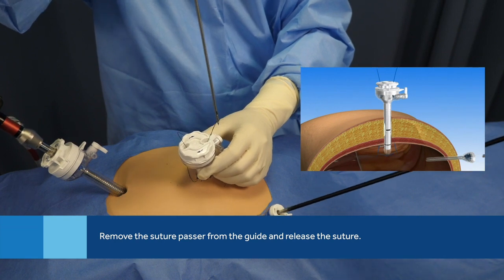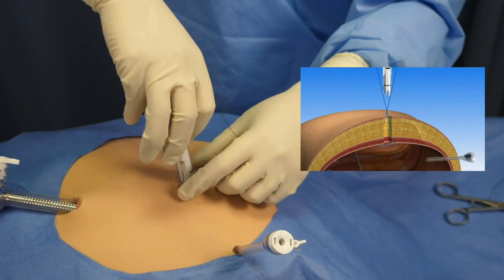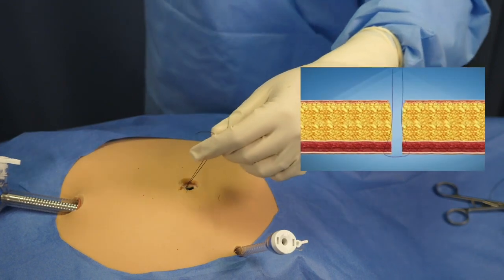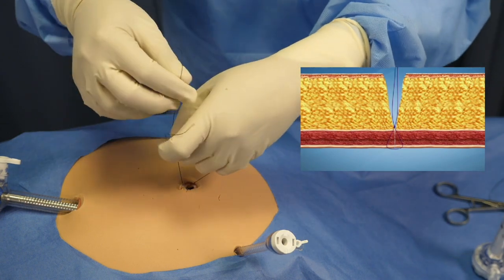Close the jaw and remove the suture. Once the suture passer is fully removed from the guide, release the suture. Remove the trocar assembly. Tie a knot to close the fascia.